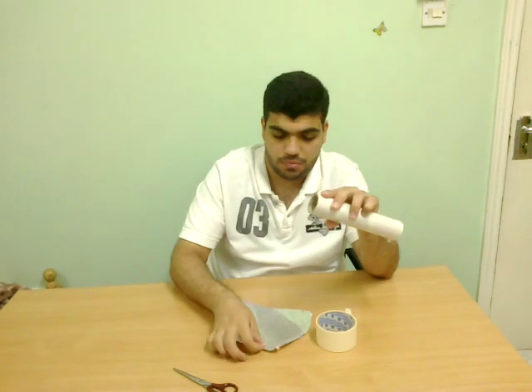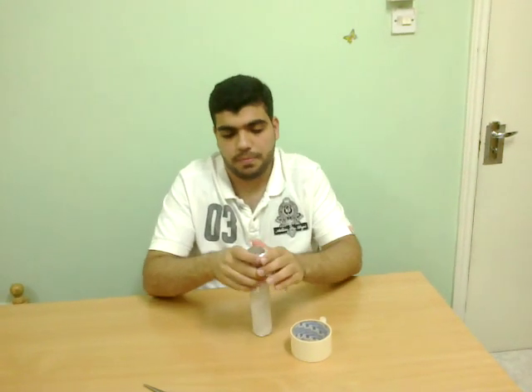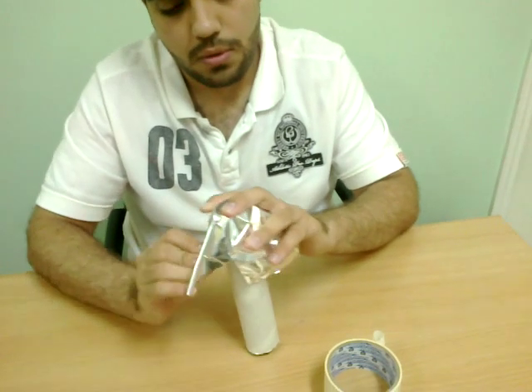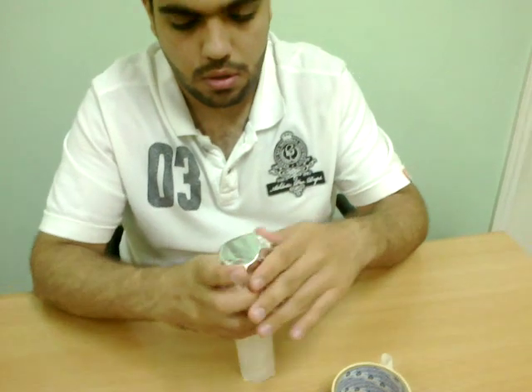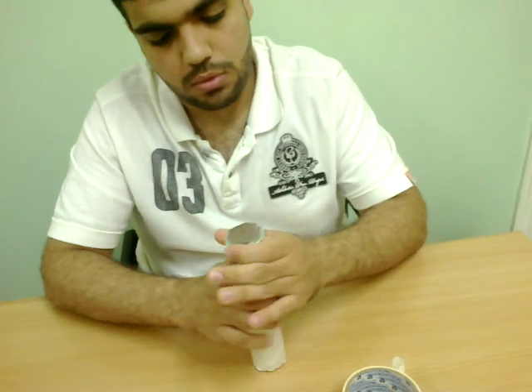First, wrap the aluminium foil over the end of the cardboard. After that, use scissors to neatly cut the ends of the foil so your stethoscope looks better.